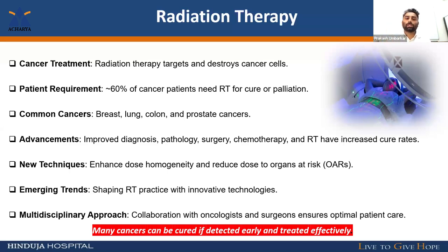What is the benefit to the patient? To increase the dose to the tumor volume and give minimum dose to the surrounding tissue. While delivering radiation, we know that radiation is hazardous for every human body. If unwanted parts receive the radiation dose, it may harm the patient and reduce the quality of life. So we require precision and accuracy in the treatment delivery.